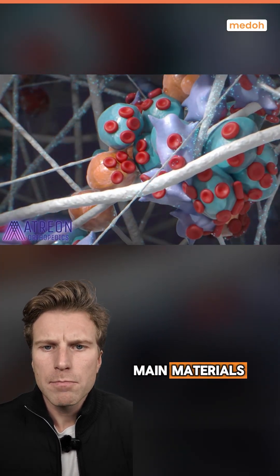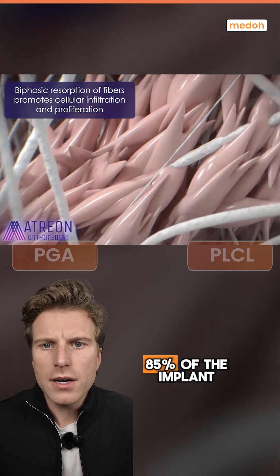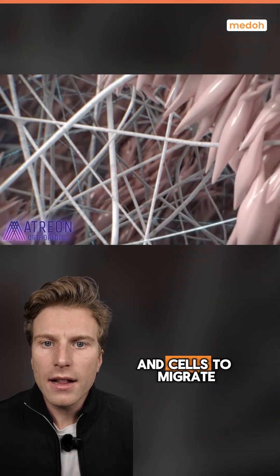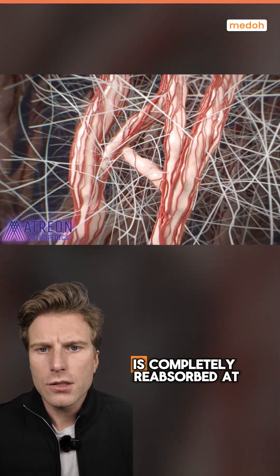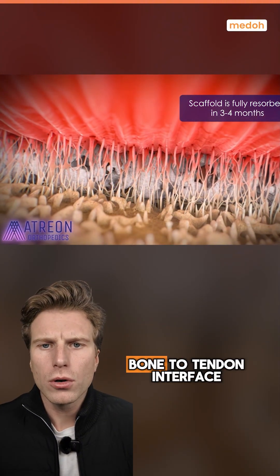It's made from two main materials, PGA and PLCL, and 85% of the implant is extremely porous, which allows blood, bone marrow, and cells to migrate and be absorbed and soaked into the implant. Over time this helps with the healing process. This matrix is completely reabsorbed at three to four months and encourages a stronger bone-to-tendon interface.